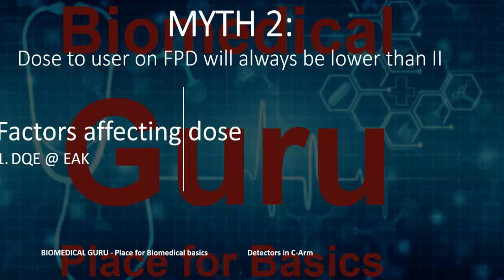In simpler terminology, DQE is the efficiency of a detector, and EAK you can consider as how much dose you are giving per pulse. The DQE at EAK is nothing but the efficiency of the detector at that particular energy level.